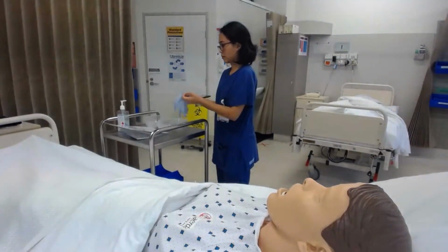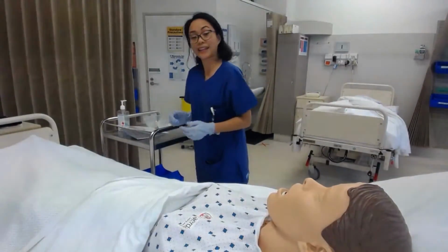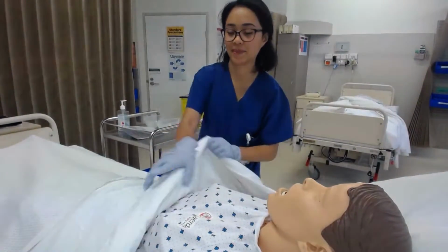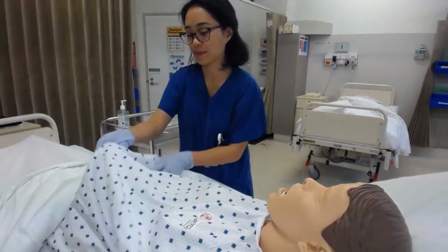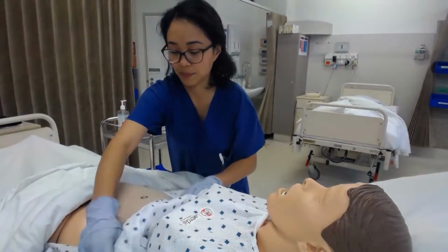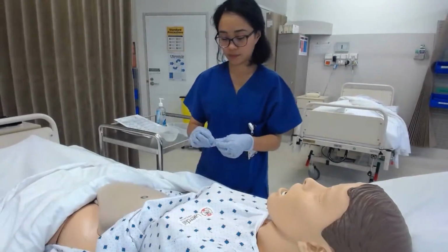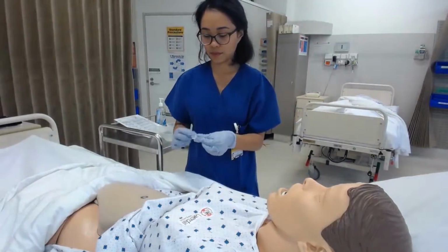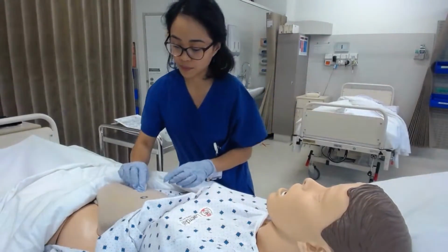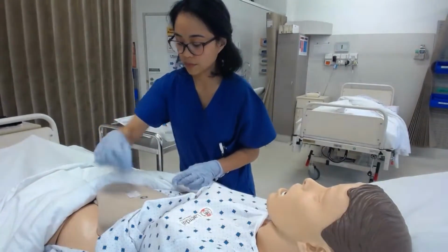Select the appropriate injection site. The site most commonly used for subcutaneous injections is the abdomen. Clean the site with an antiseptic swab. Apply the swab at the center of the site and rotate outwards in a circular direction for about 5 centimeters. I leave the alcohol swab there, pointing at the site where I have cleaned.